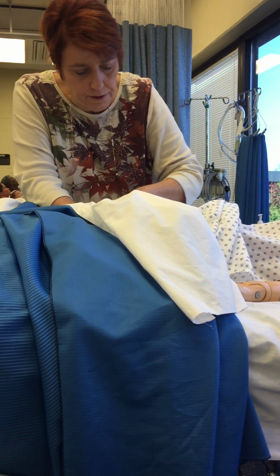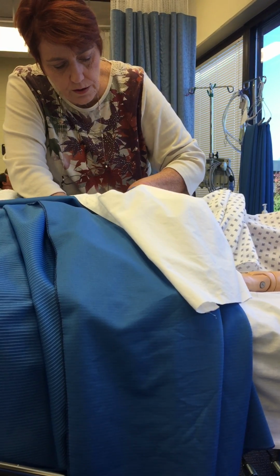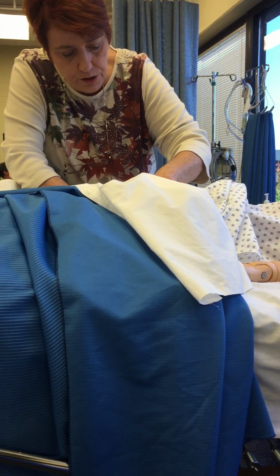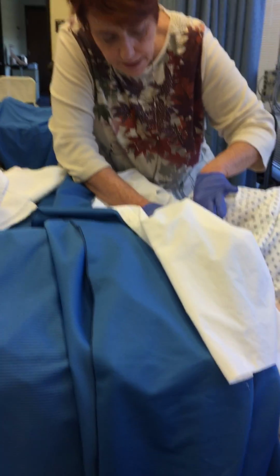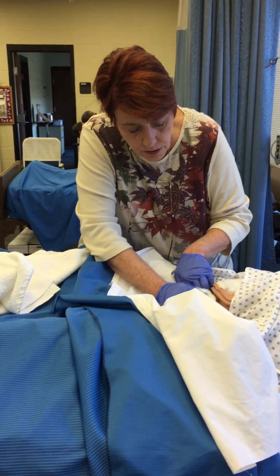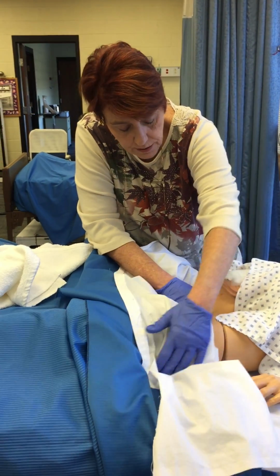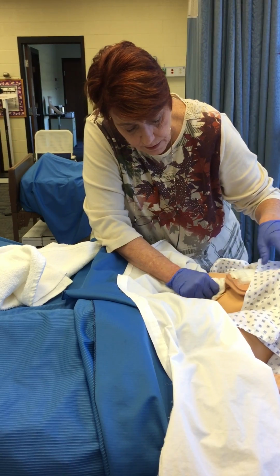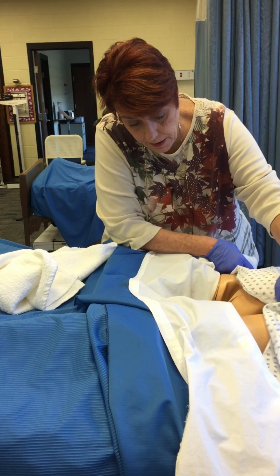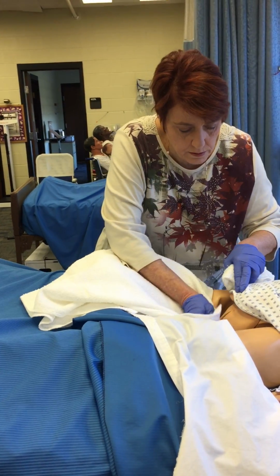While I'm washing down here, that's a good time to locate the urinary meatus, because sometimes on your female patients it's not that easy to find. So another good idea is to have an assistant come with you that has a flashlight or some kind of light to shine down here. That's a good job for a CNA if you have one, or anybody else that will help you. I want to dry this area good.